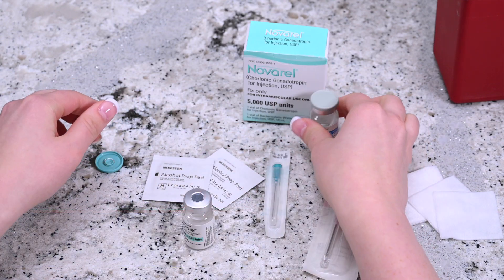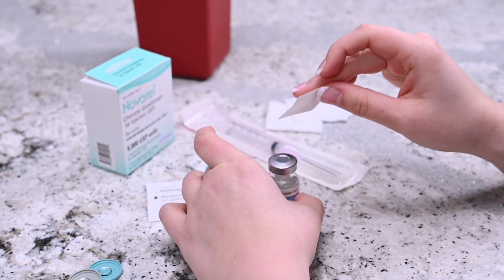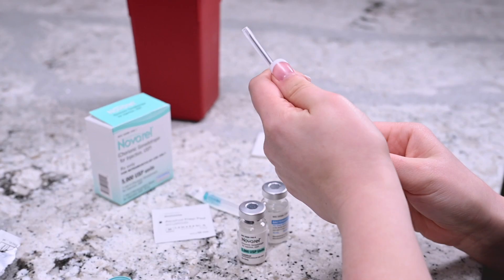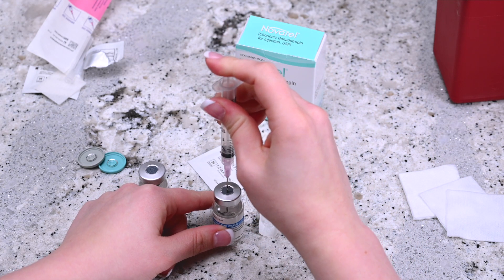Remove the cap from both vials and disinfect the top of the vials with the alcohol pad wipe. Hold the syringe upright and draw in the same amount of air as the dosage required. Insert the needle into the center of the Navarrel solvent vial and push the plunger down until all the air enters the vial.